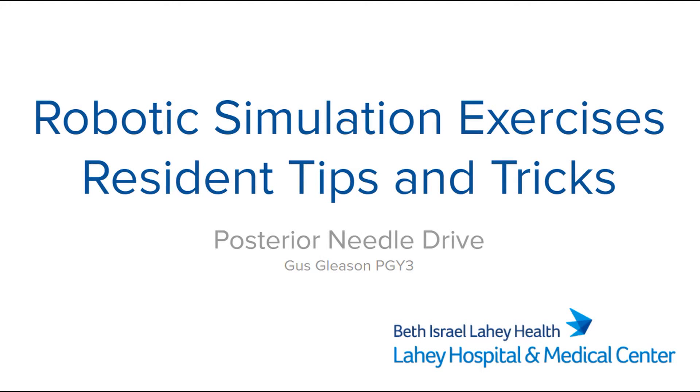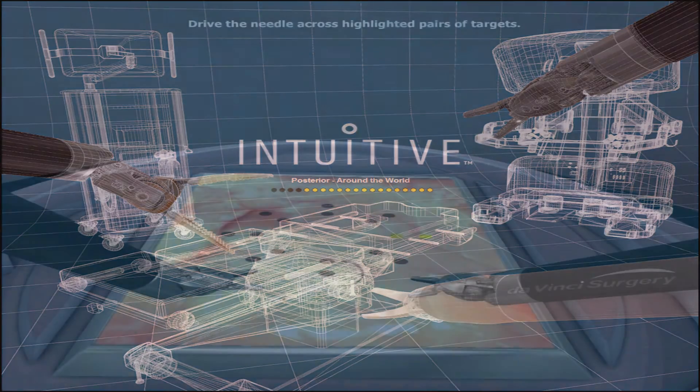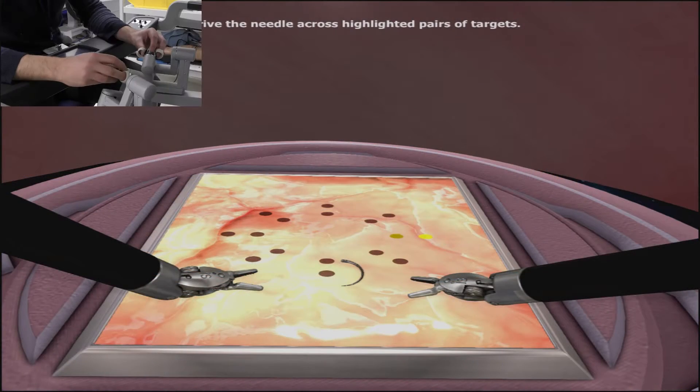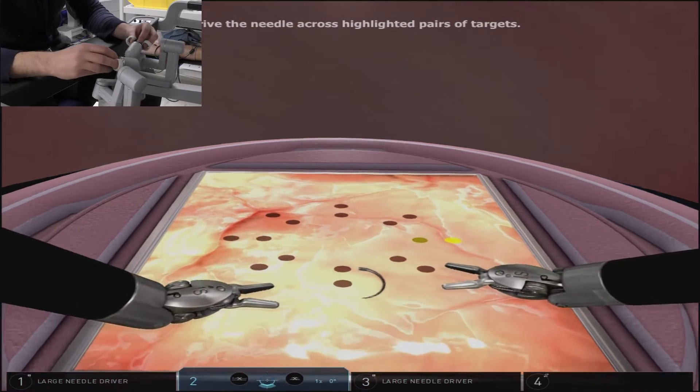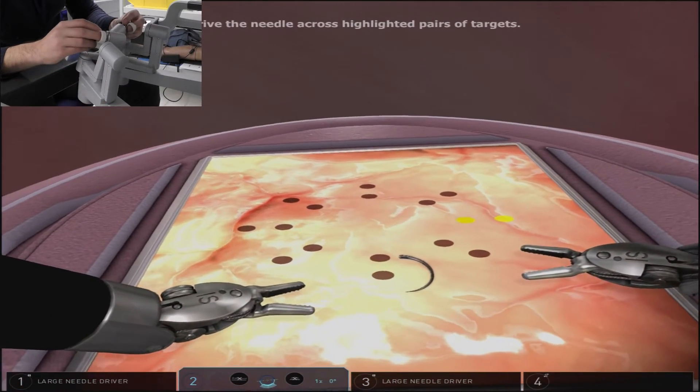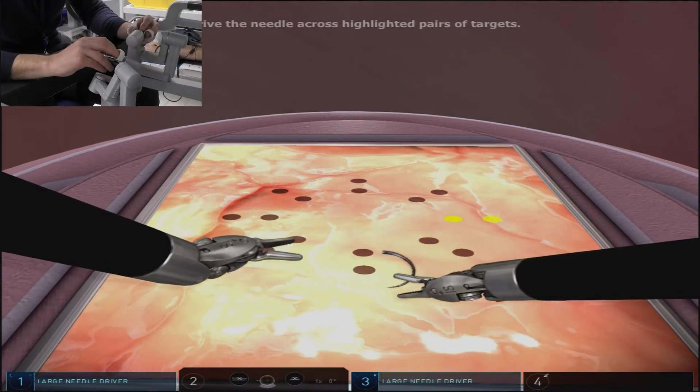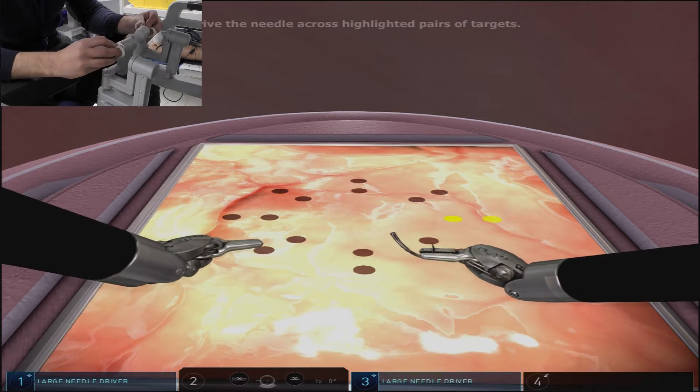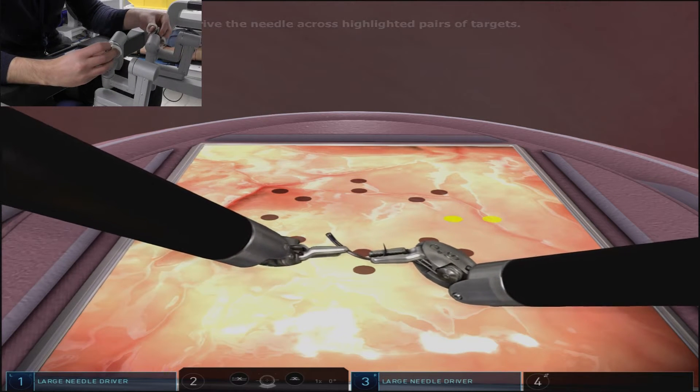This is the posterior needle drive exercise. It will require you to suture on a downwards posterior surface in a circular or around the world fashion. The exercise will start you screen right with a horizontal oriented throw. It will then progress in the clockwise fashion.